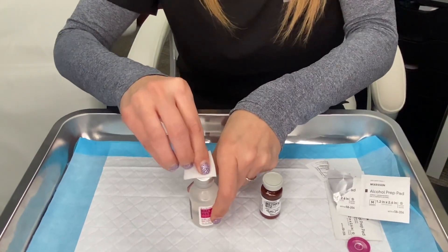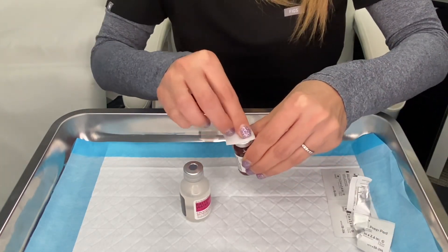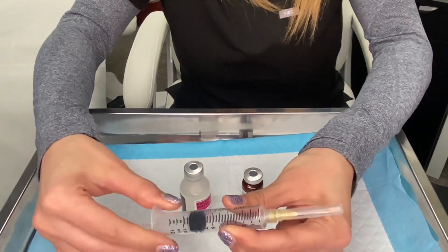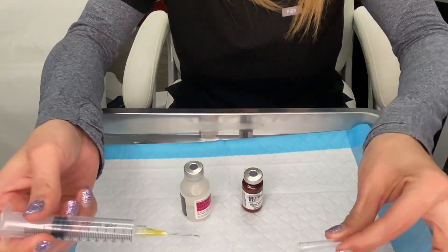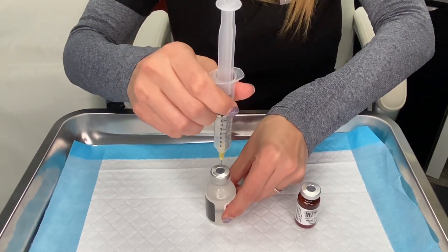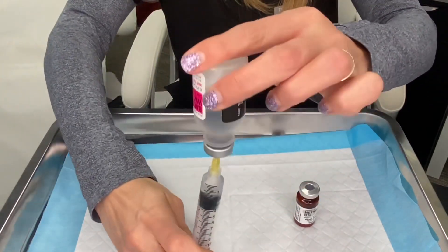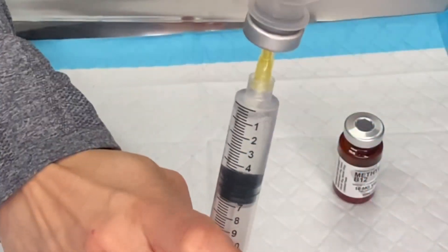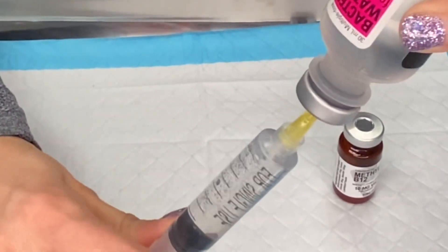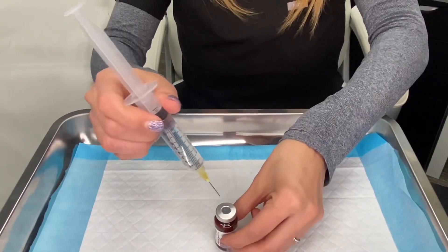You want to do this anytime you're going into a vial with a syringe. Then you're going to want to draw up some air into your mixing syringe — this makes it easier to withdraw the sterile water. You can push the air in, then invert the vial, pull back on the plunger, and withdraw 10ml of sterile water into the mixing syringe.